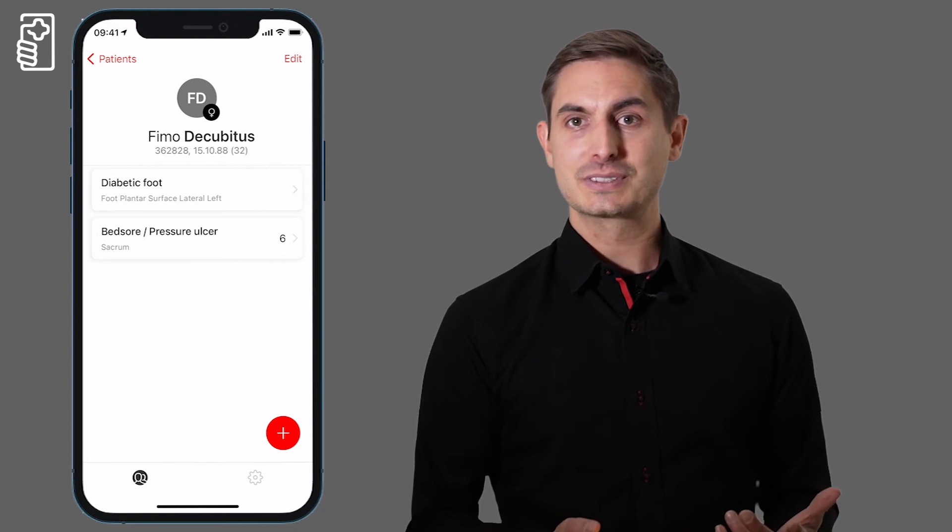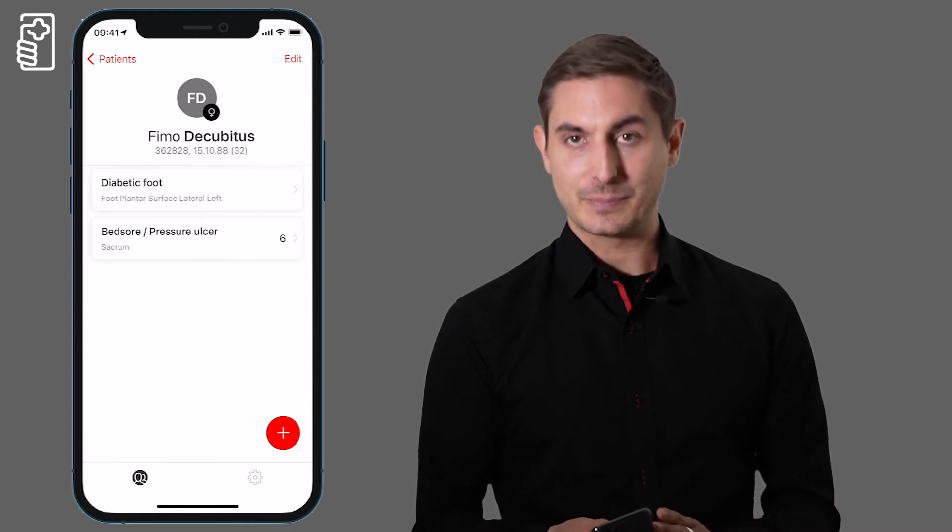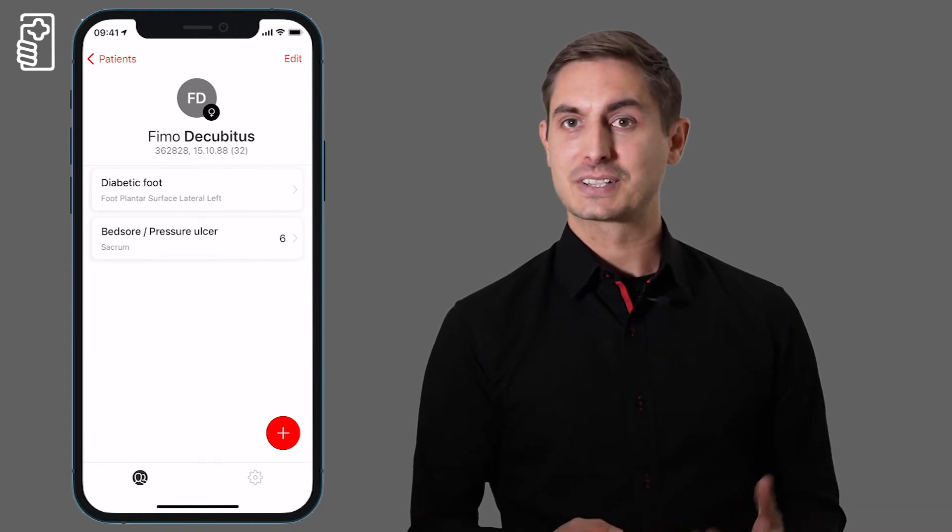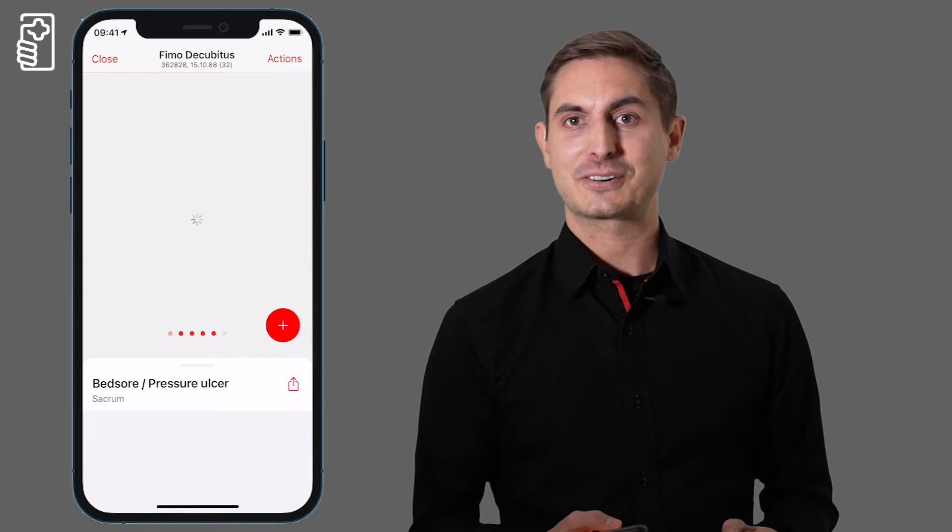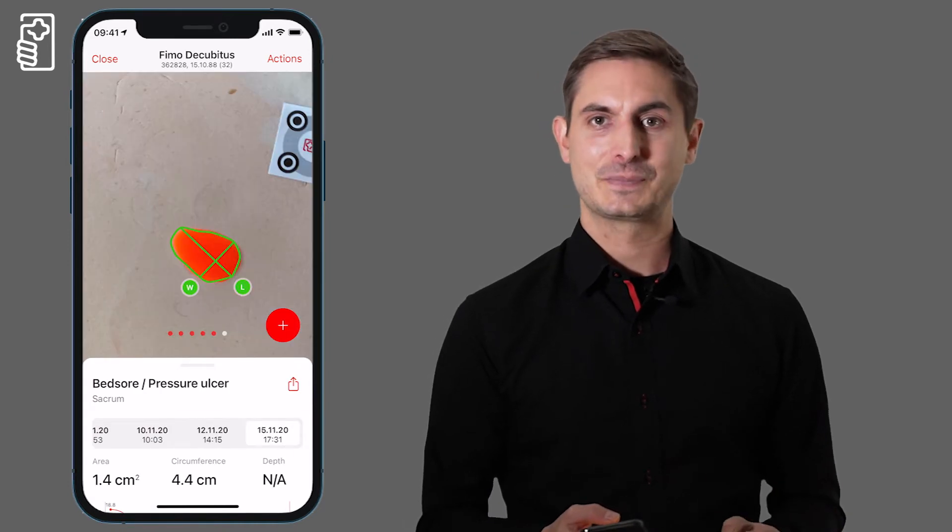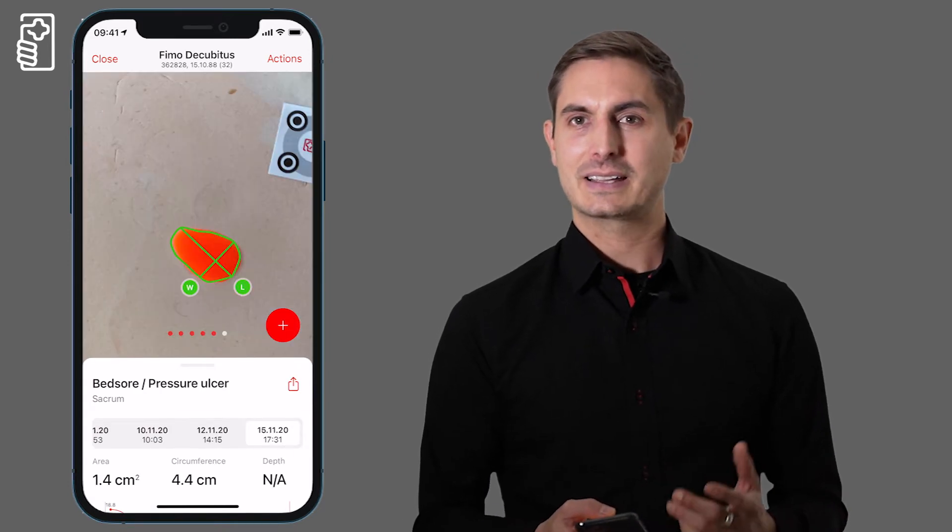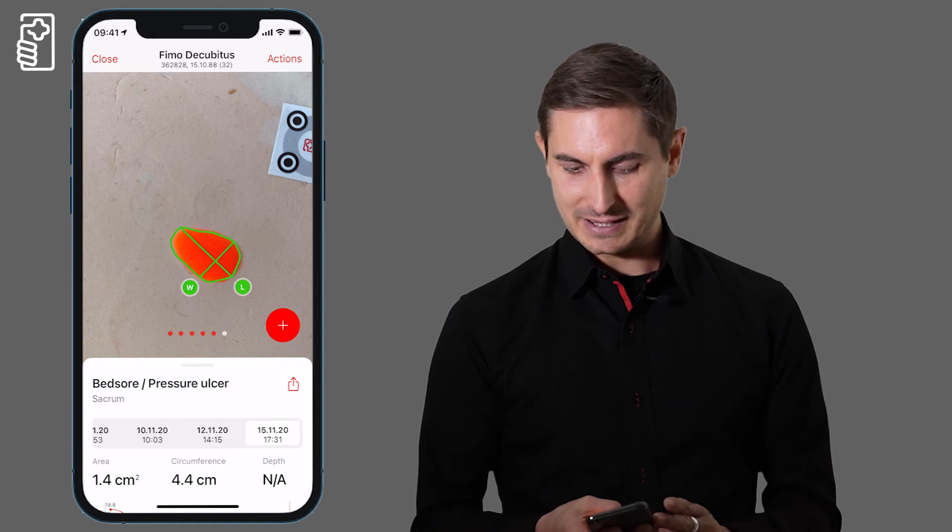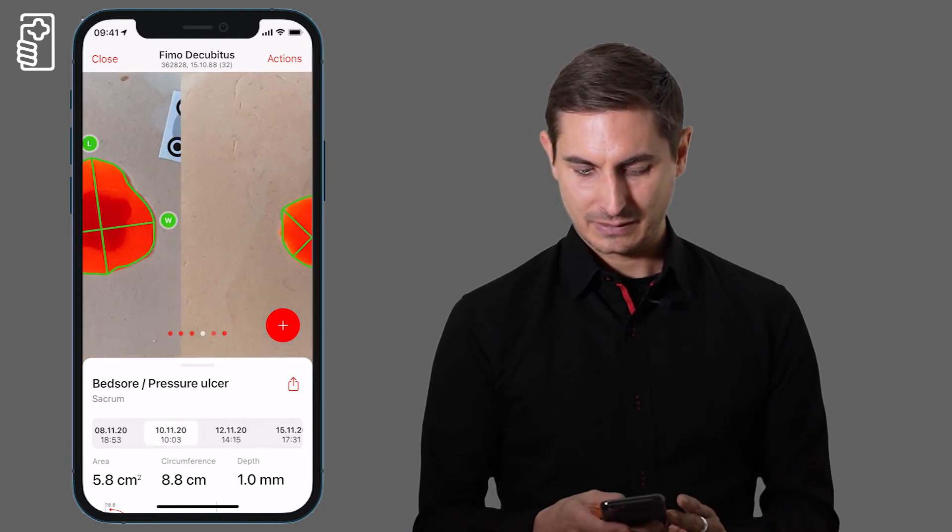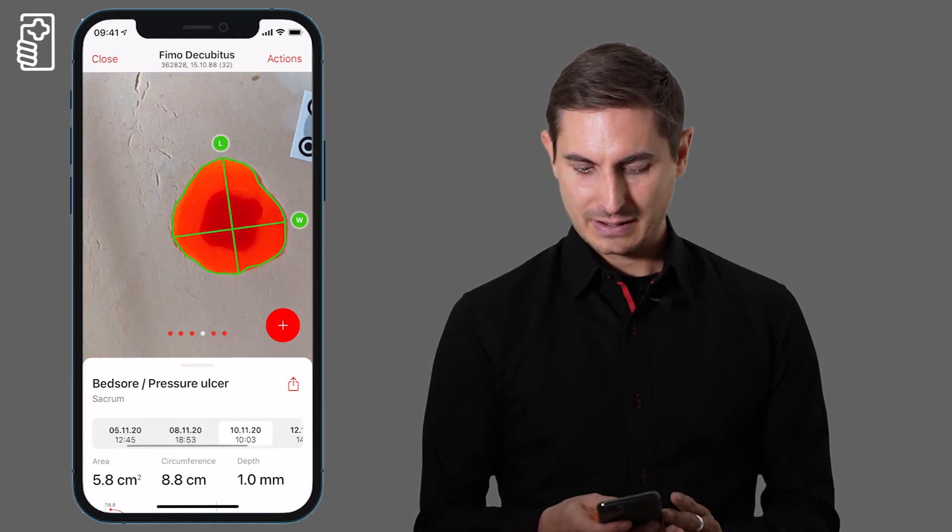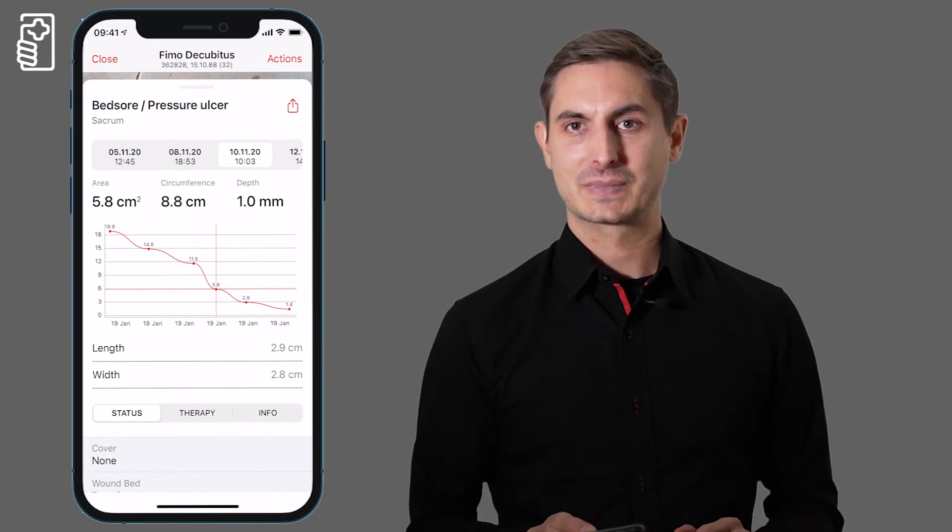For each wound, for example this bed sore on the sacrum, all assessments are displayed in the timeline. I can navigate between the assessments and see the healing progress over time.